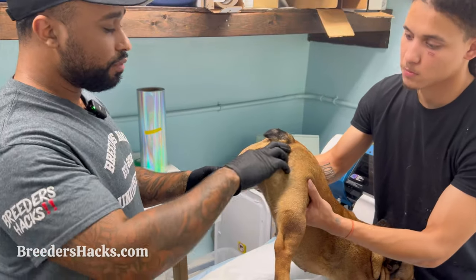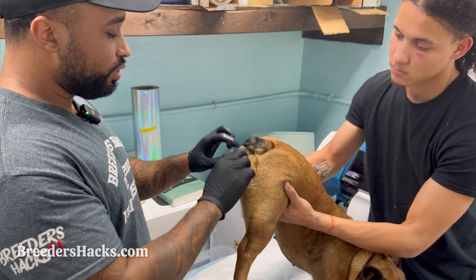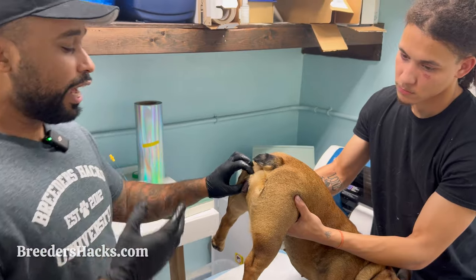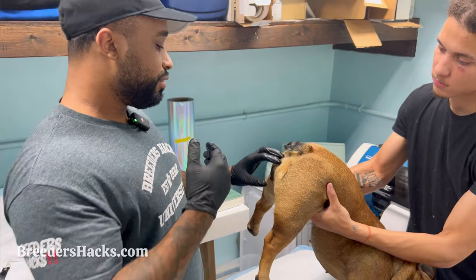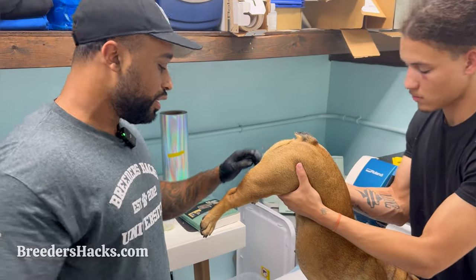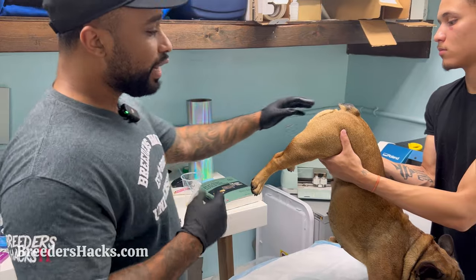Hold her up for a little bit — I'm going to tickle her sides so she tracks the semen and pulls it further in. Essentially, when you're doing the TCI, you want to make sure you're putting the semen into the uterus. That's the key thing — otherwise you're really just doing a glorified AI. Placement is everything.